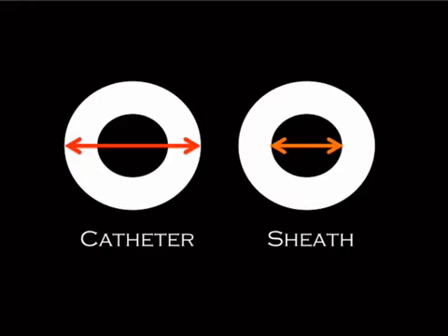Now usually when you stick a sheath in somebody, it causes a hole that's 2 French larger than the measurement for the French. In other words, if this is 10, then it's a 12 French hole, 10 in the middle, 12 total. Now greater than a 10 French sheath, you get a little bit more than 2 extra. But if I was going to remember the thickness, I would just remember 10.